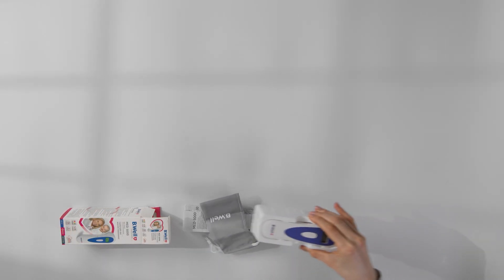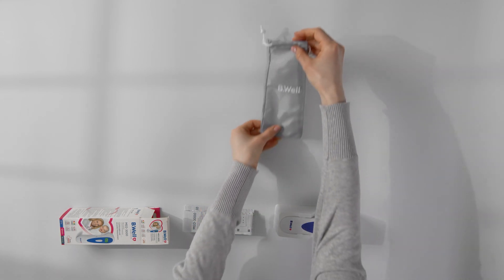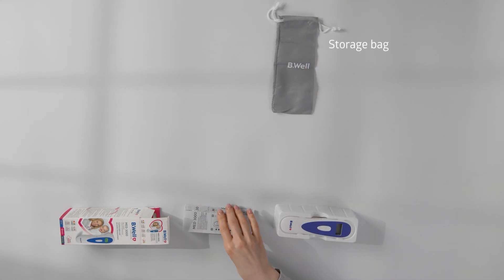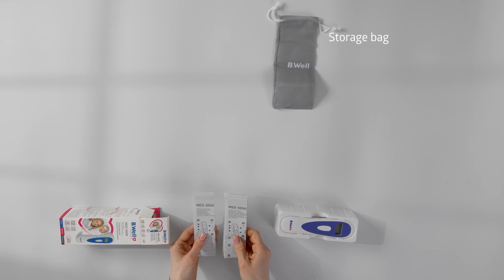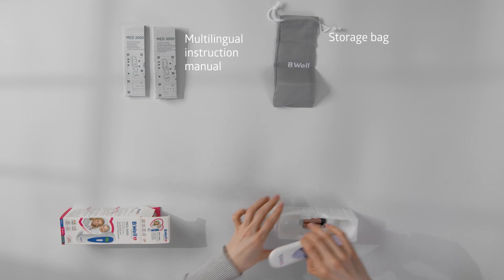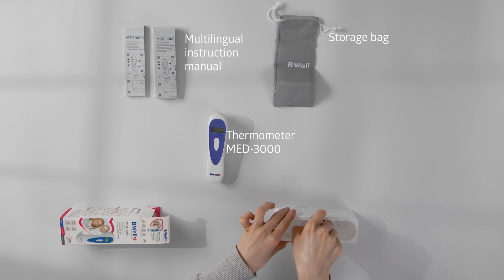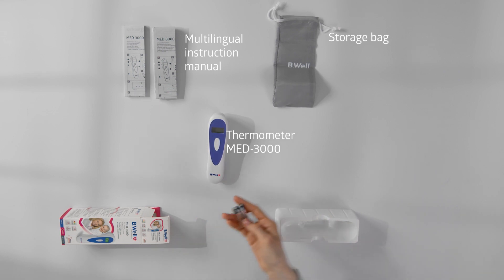Med 3000 is ready to work right after purchase. The kit includes a bag for convenient storage of the device, an instruction manual in your language, the infrared thermometer Med 3000, and 2 batteries, type AAA.